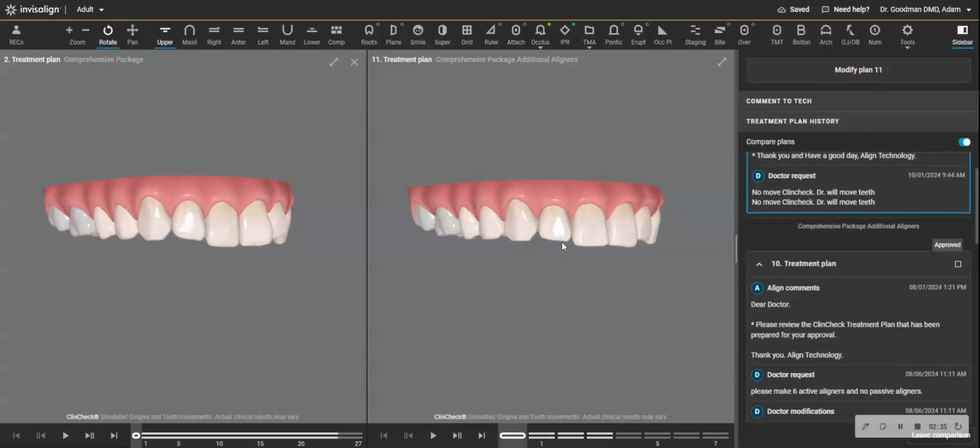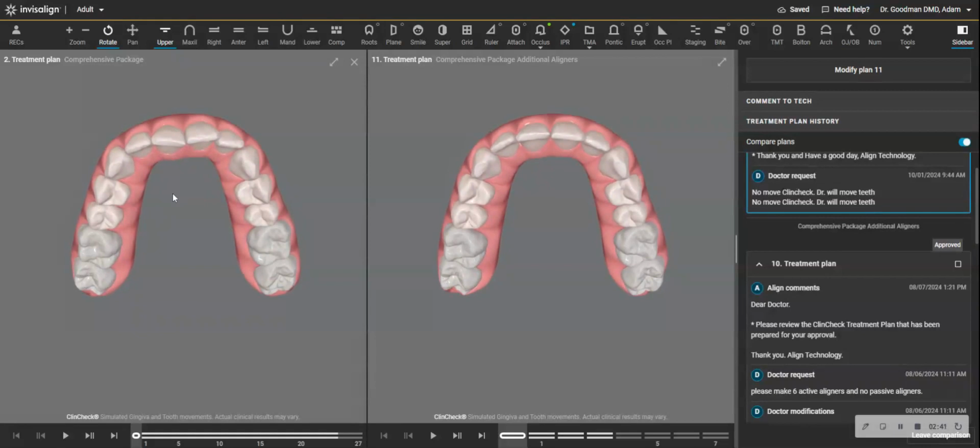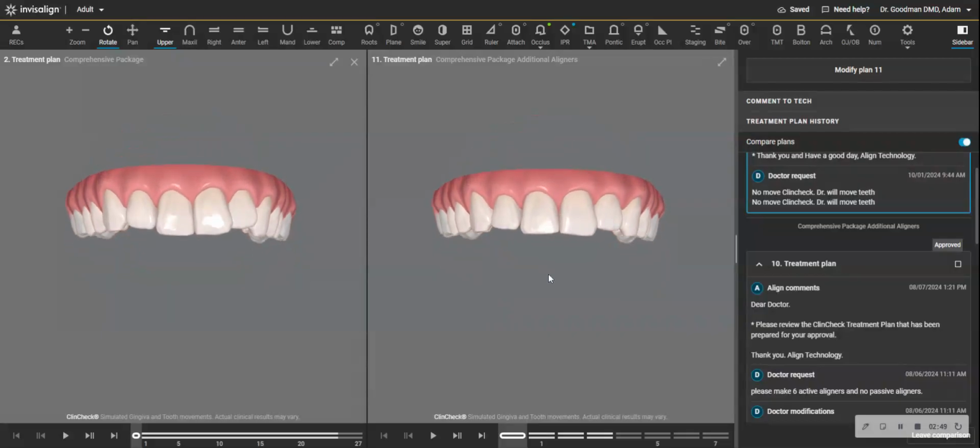And the same thing applies a little bit to this tooth as well, which you can see was slanted from the beginning of the treatment. So these are things you have to deal with in an orthodontic case. And Invisalign really brings these things to the forefront because you have this great imaging tool to help guide you and to educate patients.